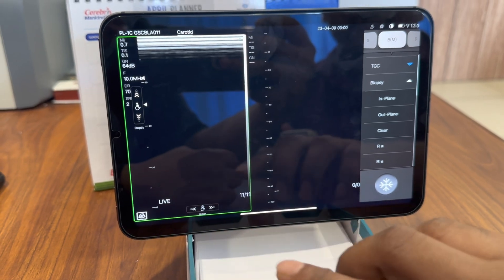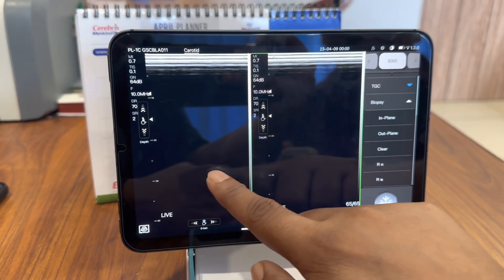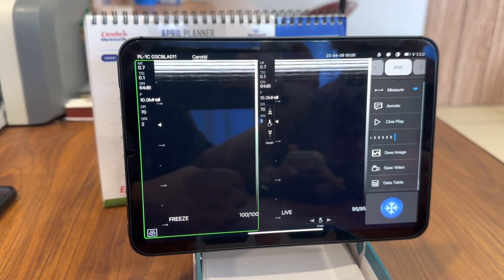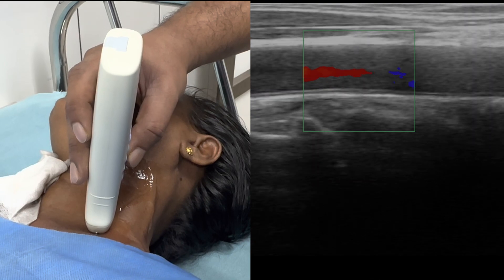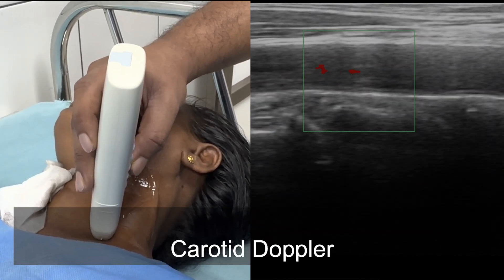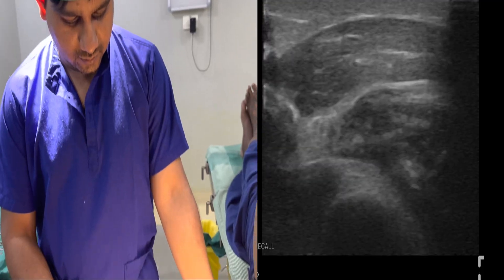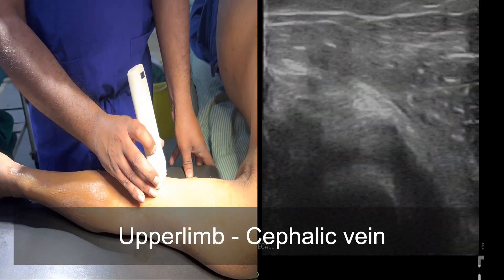This is the dual screen mode — you can split the screen into two screens. Here are some of the sample ultrasound images.